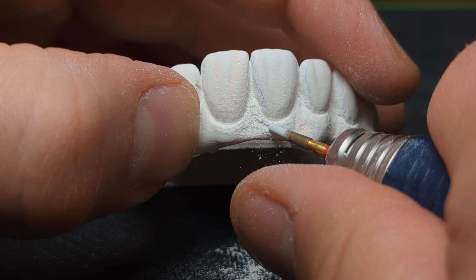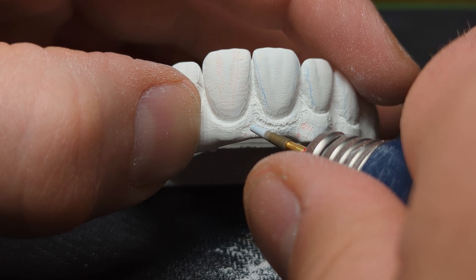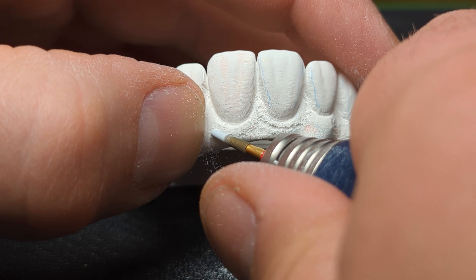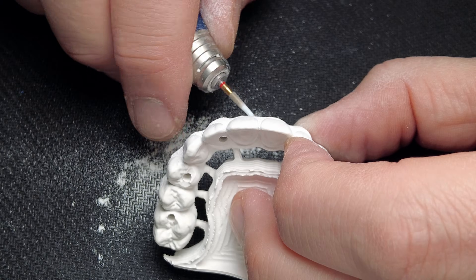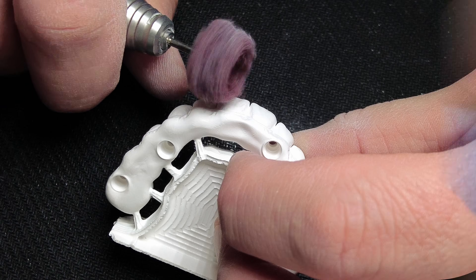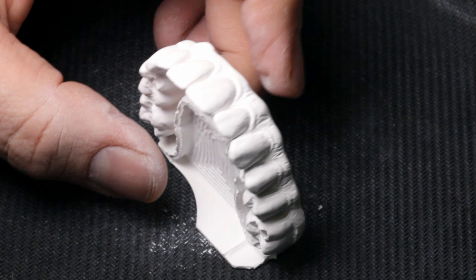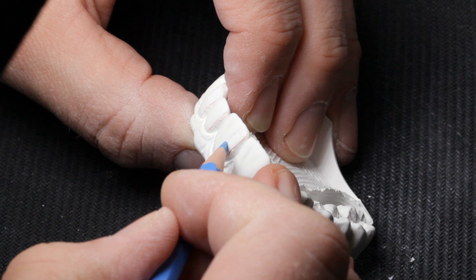Especially the free margins — the defined areas where the eye is naturally drawn to. Before moving forward with the surface texture, I usually buff out the zirconia to give it a smoother surface. You can also apply all the techniques for surface texture in ceramic work. I have seen technicians who try to grind the surface texture in solid zirconia — I have even seen people taking a high speed and redefining occlusal anatomy on posteriors.